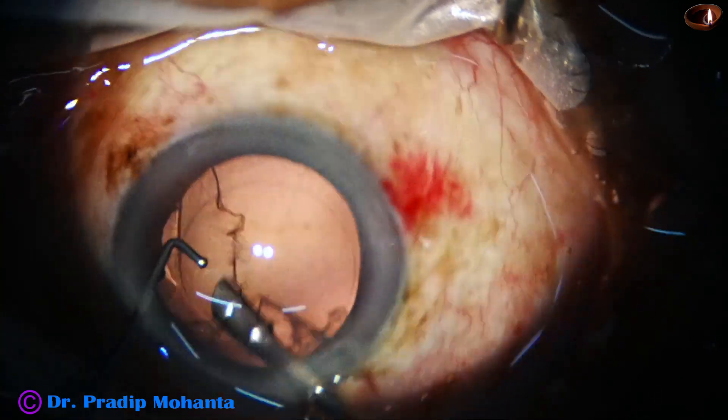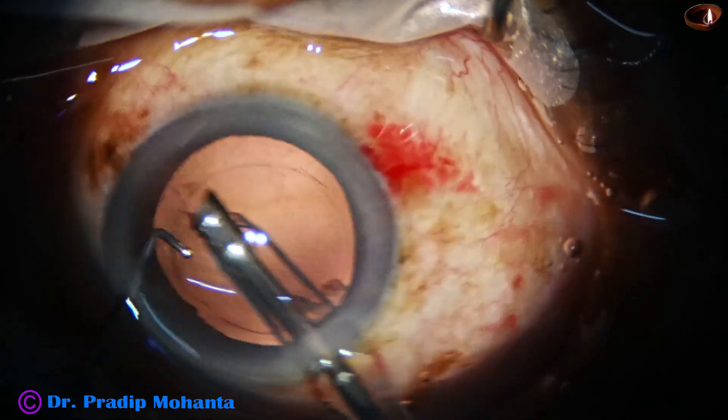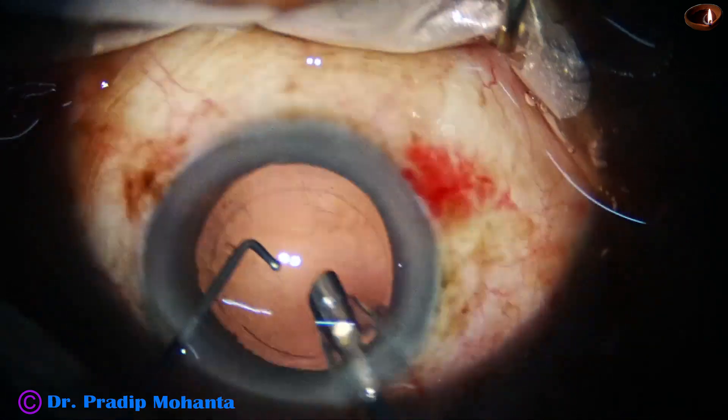You can do this step with bimanual IA or coaxial IA. It is not necessary that you have to do this with the phaco handpiece itself.